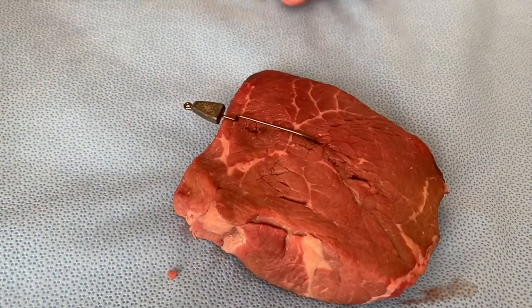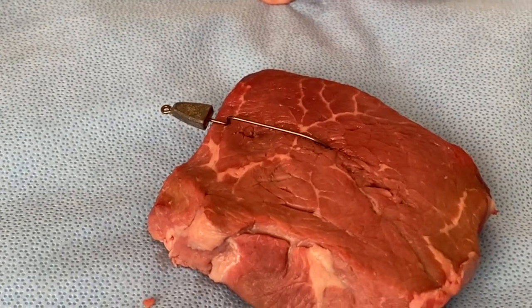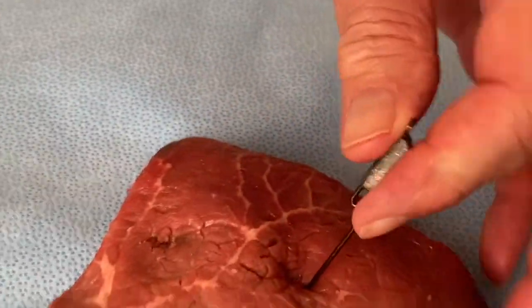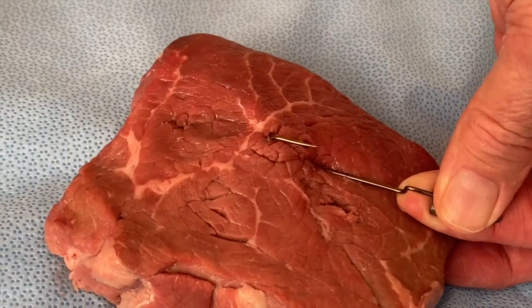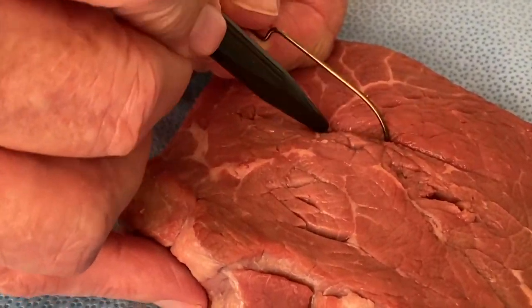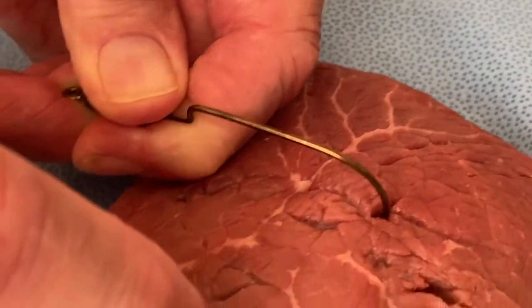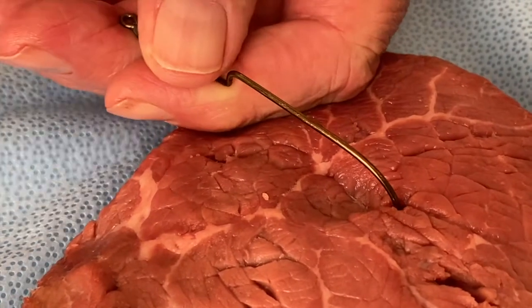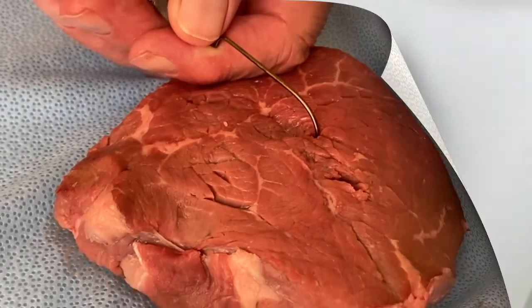Technique number three is situational: figure out what to do based on the specific circumstance. Sometimes you can just pull the hook all the way around and cut it off. If it's in much deeper, you can make a laceration with a scalpel in both directions, wiggle it around, and the hook will come out. That leaves a small laceration which you can usually leave open depending on cosmesis, or put one stitch in.